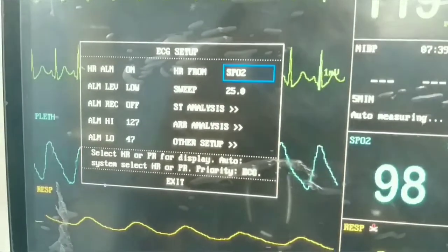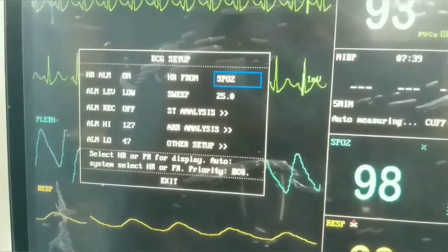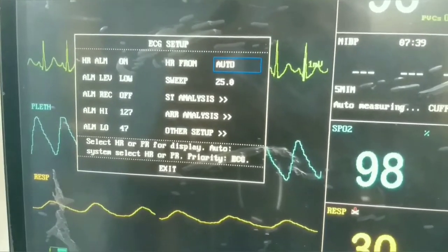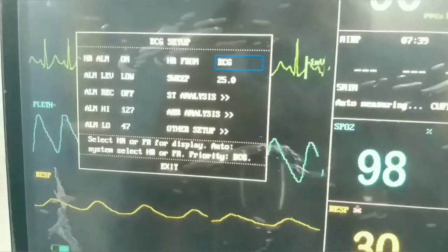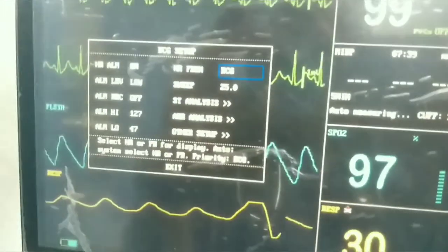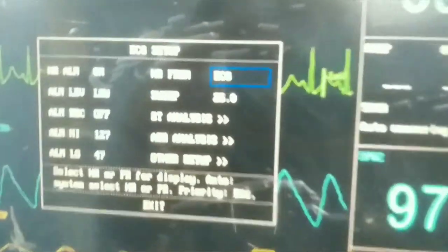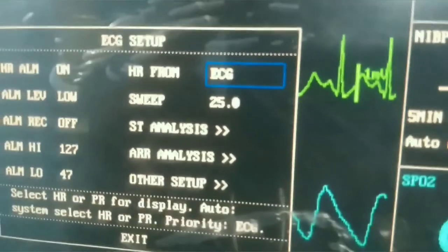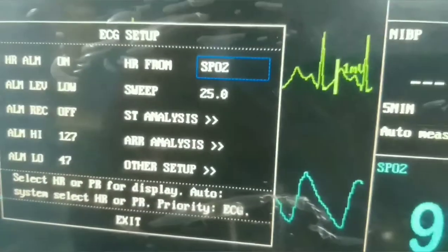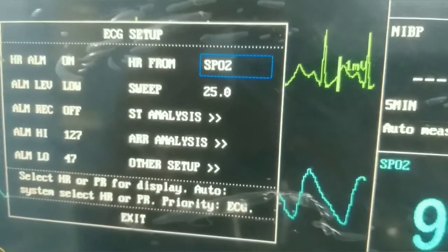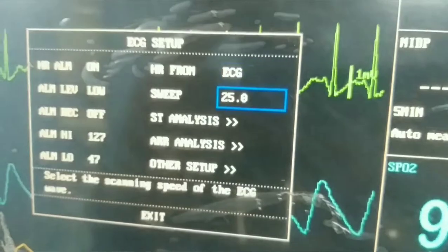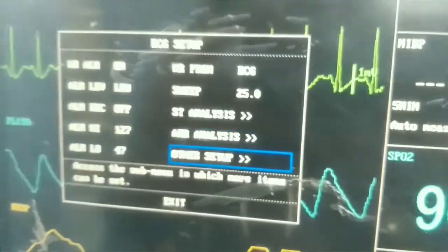There is also an option for sweep speed. Sweep speed can cause false tachycardia or bradycardia. The normal speed is 25 mm/s. Setting it to 50 mm/s causes apparent bradycardia, and 12.5 mm/s causes apparent tachycardia.